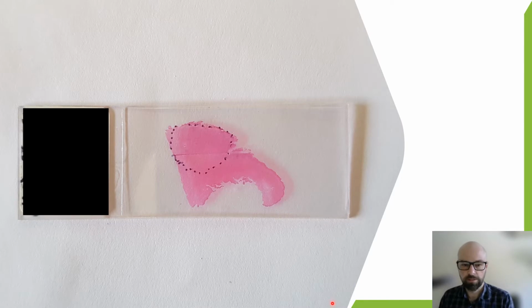For a larger tumour, where you do need to take the microscopic measurement from the slide itself, I use the really high-tech method of looking down the microscope right at the border of the tumour, and then putting little dots around where that is, and kind of marking the outline of the tumour. And then just getting a ruler and overlaying that on top of the slide and then taking a measurement there. It's not the greatest method for smaller tumours because you can be out by a millimetre or two, but for larger tumours, it can be okay.